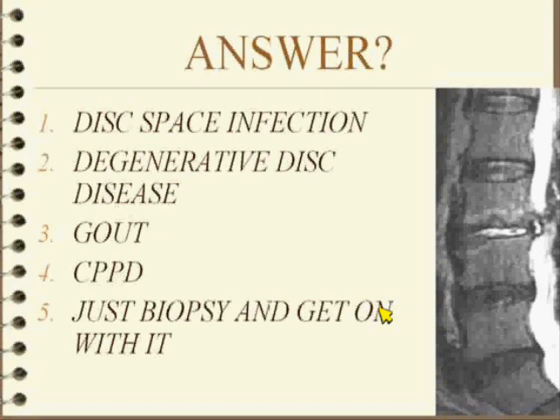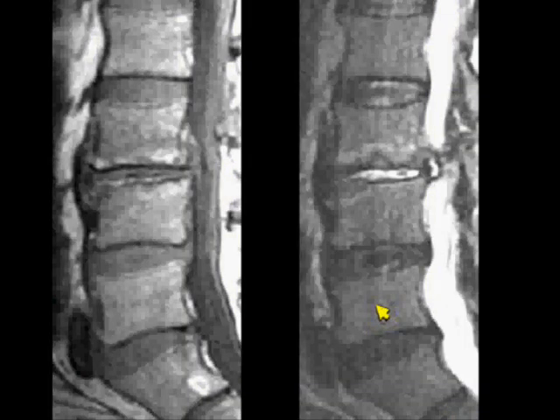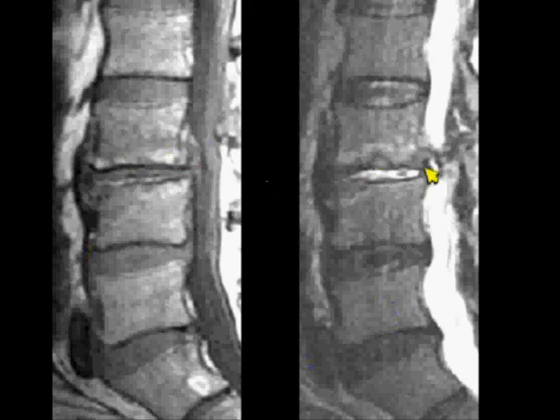The answer — you said degenerative, and you don't know how good you made me feel, because that's what I called on this case. I'm an expert on this, so I know this stuff. Here we have degenerative end plate changes, type 2. I'm really happy when I see degenerative end plate changes like this. I've got a little high signal in the disc, but I've got degenerative end plate changes — cracks and fissures within the disc. No big deal.